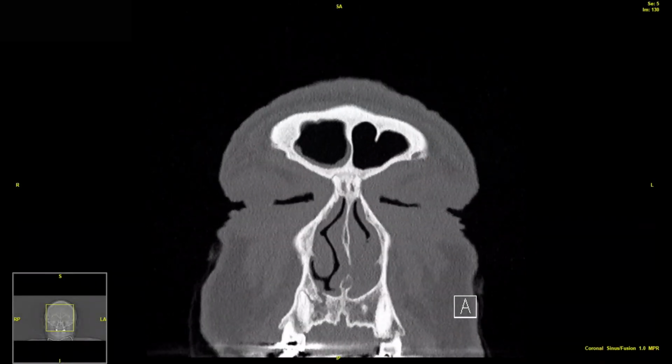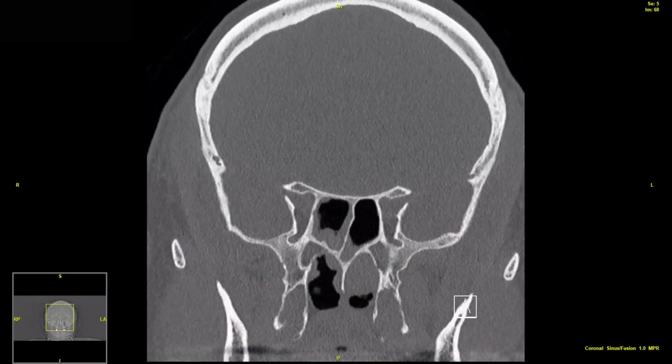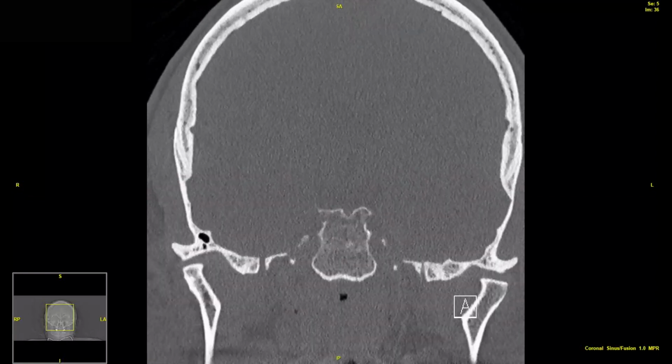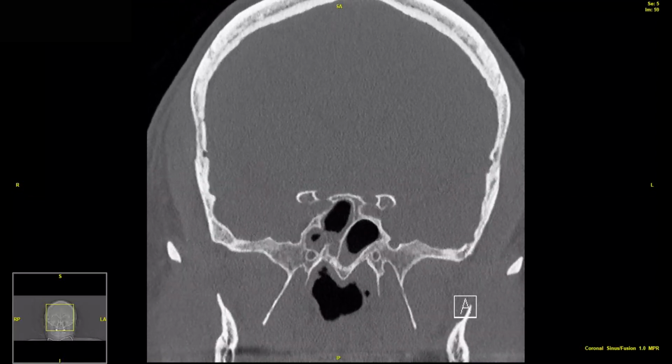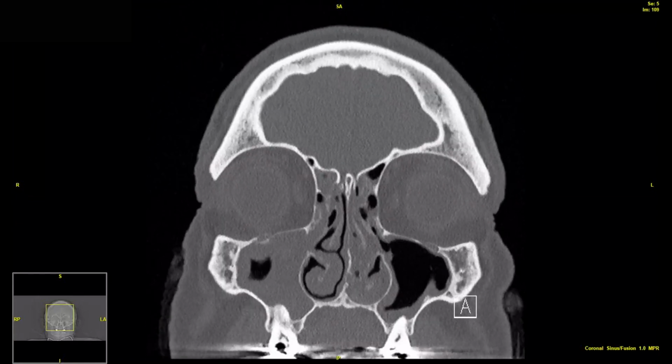As you can see on the patient's preoperative imaging studies, there's a left-sided sinonasal tumor taking up the majority of the nasal cavity, and on this upcoming still image, you can notice that there is an area of thick hyperostotic bone in the posterior ethmoid cavity in the circle there that denotes the likely primary attachment point of this tumor right along the skull base in the high left ethmoid cavity.